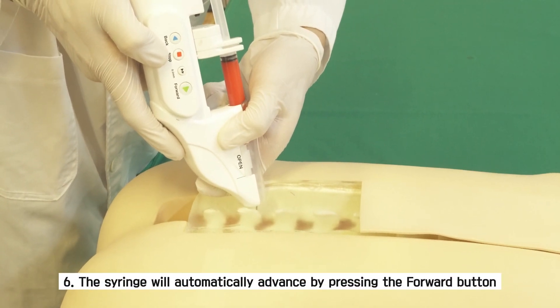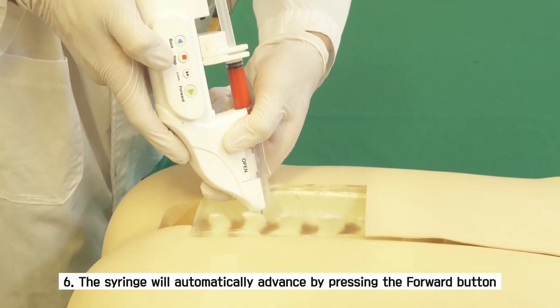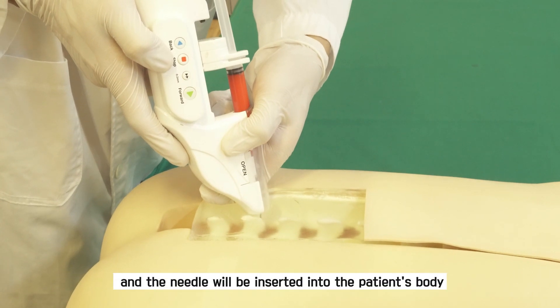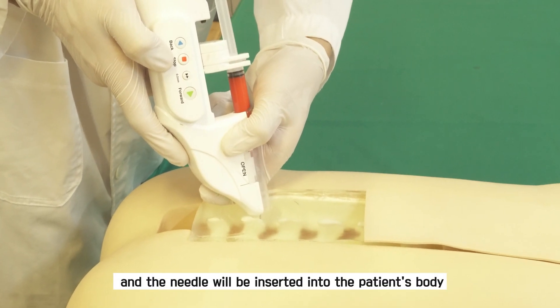Sixth, the syringe will automatically advance by pressing the forward button and the needle will be inserted into the patient's body.